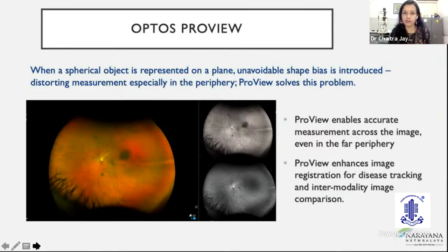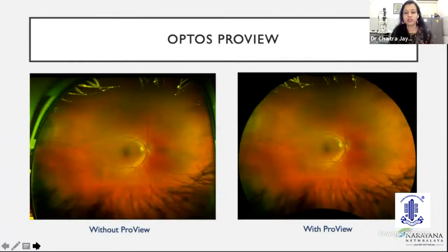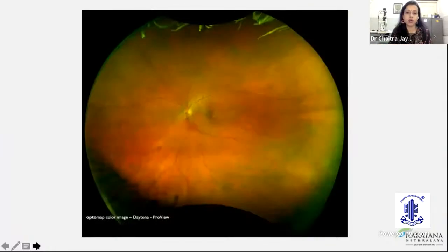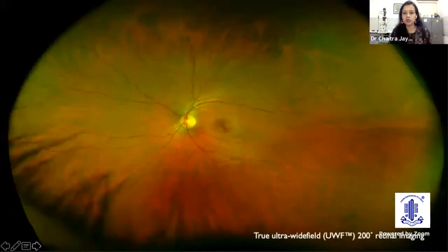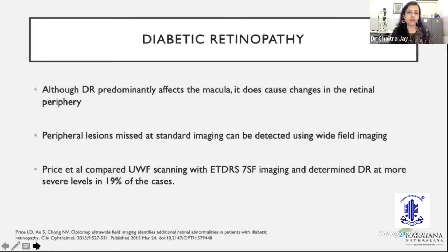Like I mentioned, you have a color picture, you have FAF, you have FFA and ICG. So this particularly helps us also with that. If you look at this, this is without ProView and this is with ProView. It gives us a better perspective as well. So these are some other images that show how you can see it. This is a good image where you can see the ultra-wide field and the extent of the 200-degree images. Some of the retinal diseases that we've been able to capture, I have divided disease-wise into common diseases and a few uncommon ones as well.